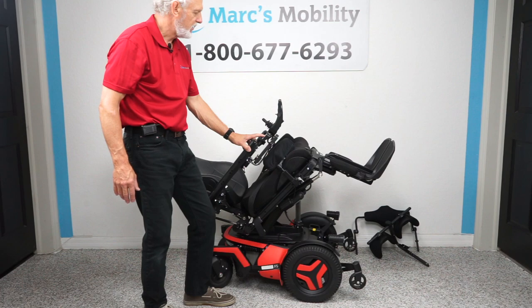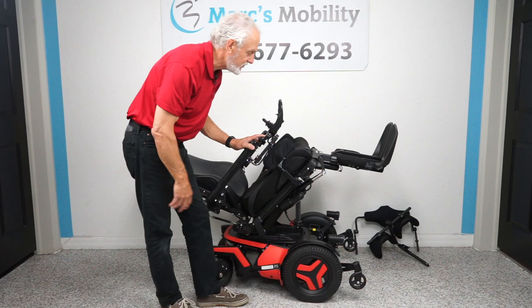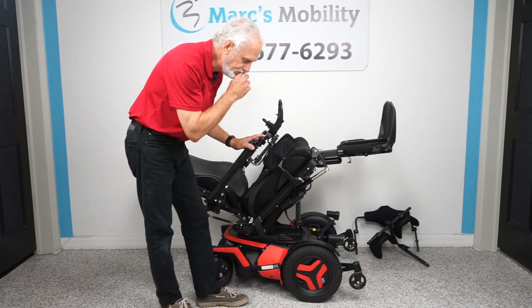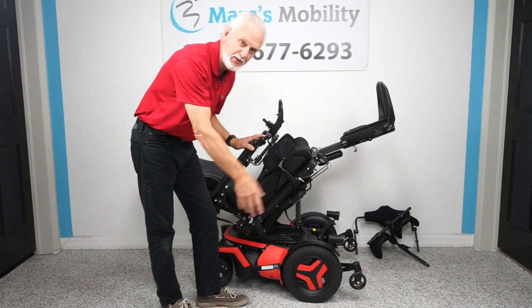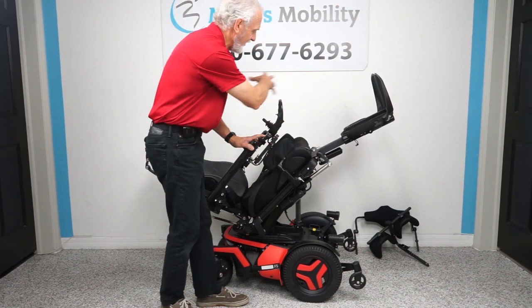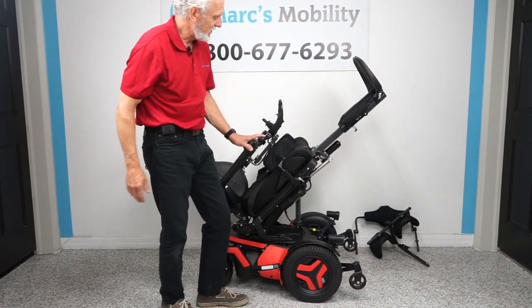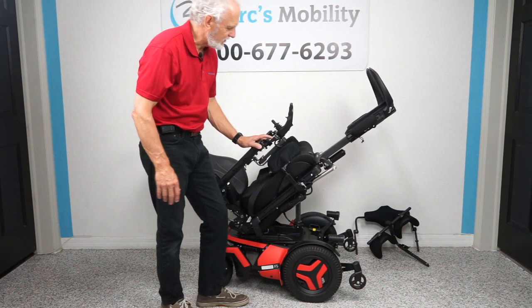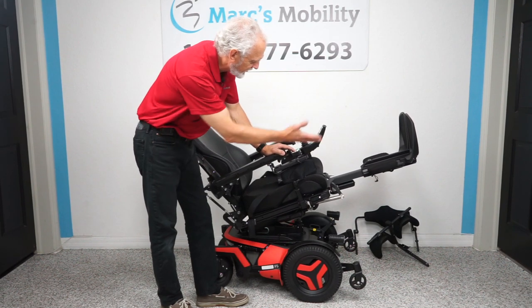With the electric tilt engaged, let's say you want to raise your feet up. I'll show you the extreme position — feet way up in the air. It doesn't matter if you're five feet tall or six-foot-two, 100 pounds or 280 pounds — we can fit this chair and change the seat size. This extreme position is for when you really need circulation, but you don't have to go this far. Even halfway tilted, your feet will still be higher than your body.